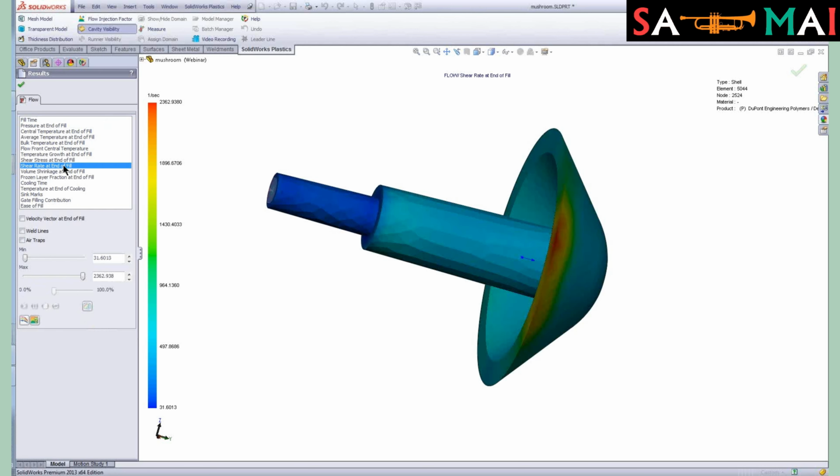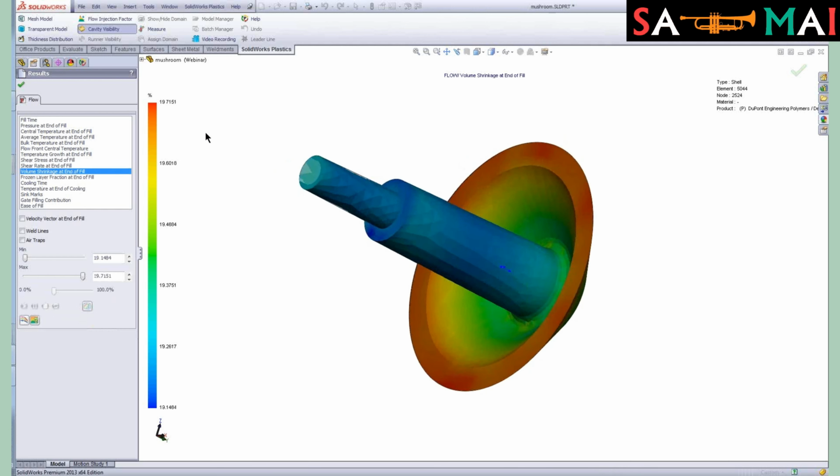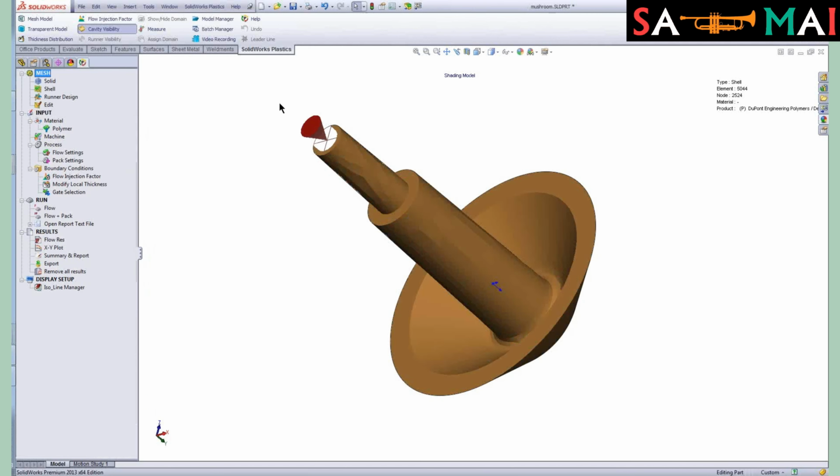And then you can see any of the other plots that we would get here. For instance, the volume shrinkage at the end of the fill. It gives us a result of approximately how much shrink might occur on the outside of that part. Now I should note that I only analyzed the fill of this component, stage 1 injection molding. I didn't do anything beyond that. And then last would be sink marks. All right, so that's a very simple model using shell mesh on the part.